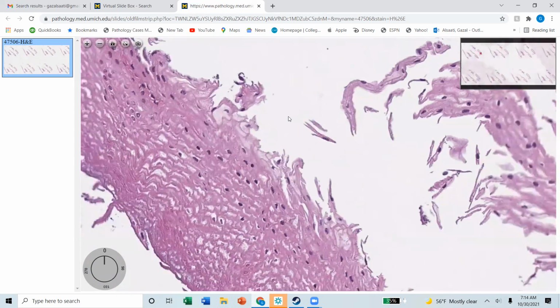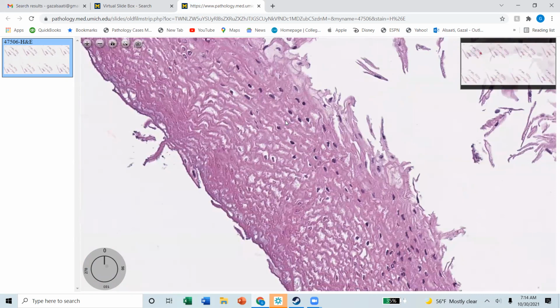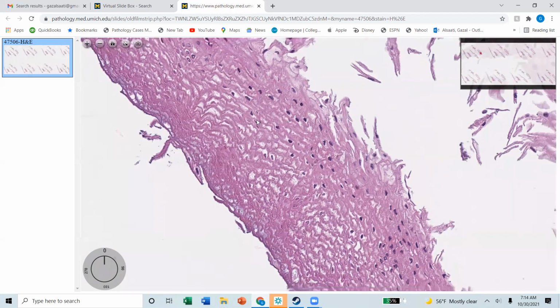So what's the cause of a sloughing esophagitis? I mean, apart from dysphagia, what type of symptoms can they have? They can have pain, dysphagia, GERD, reflux changes. Patients might have some skin problems to start with.